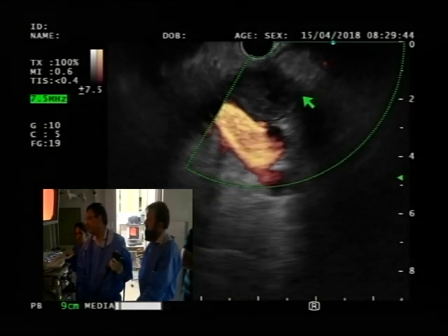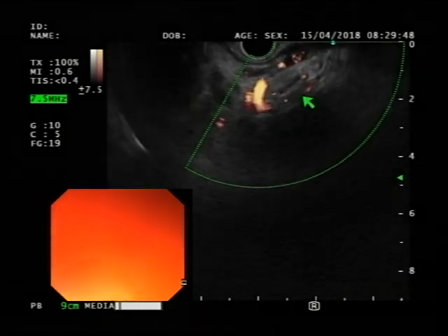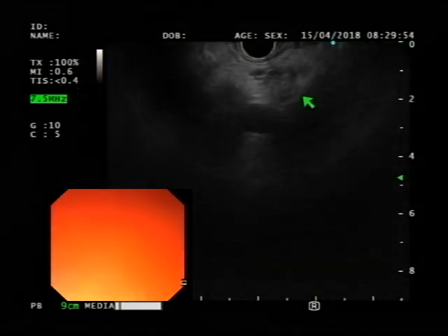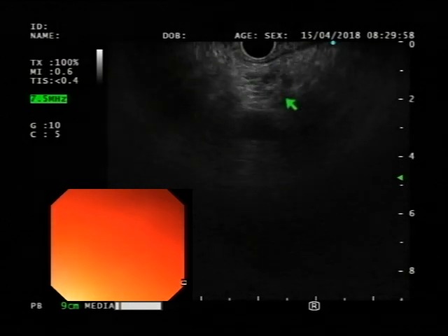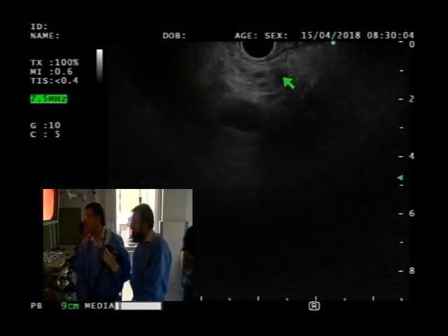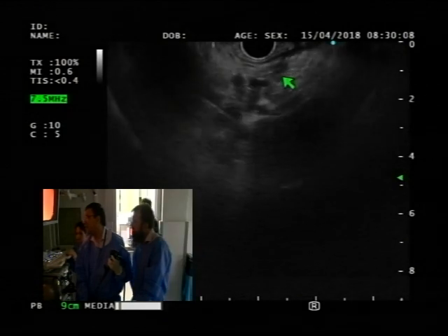Maybe just one last look from the tail towards the clot. Okay, let's do this. I will come back to the aorta right there. I'm going to take the Doppler off. So that structure, look at the pancreas right there. It's very atrophied. There's nothing in the tail area. I will follow that towards the clot. Following that, I don't see anything there.